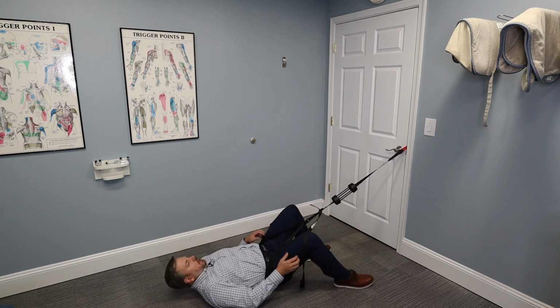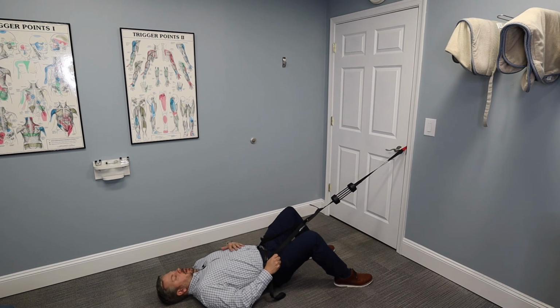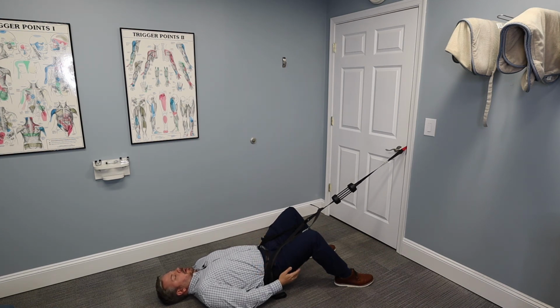Then I want you to lay down. They say you can either do it with your legs bent or your legs straight. I feel like I get more of a stretch with my legs bent. It allows my hamstrings to relax a little bit. And I'm feeling a really good pull right now in my lower back. It's just taking the pressure off the nerves and giving those discs some space to breathe and relax a little bit.